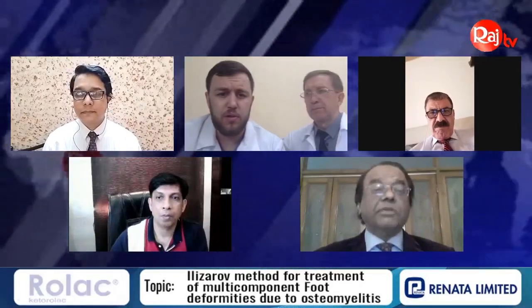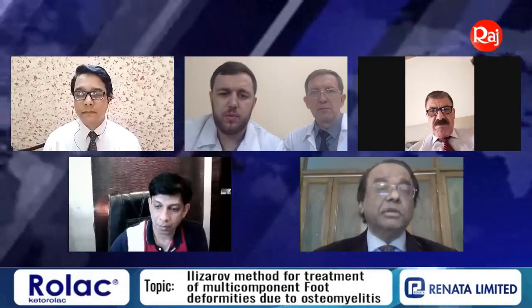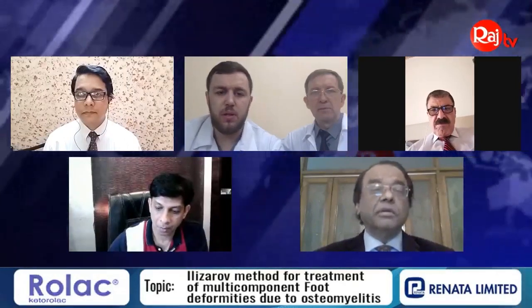Please, you can start. Yes, third or fourth day, you can start rotation. Can you hear me? Yes, sir, we can hear you. Three, four, or five days. Start where? Three or four days, double rotation. You can start as soon as you have completed it. You don't need to wait for 7 to 8 days.